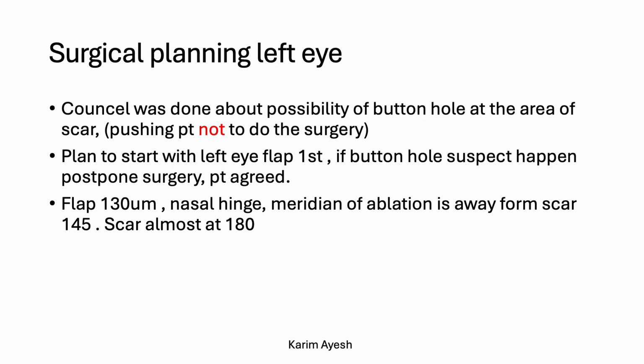So I planned to do the left eye first, or the left flap, and to watch the laser. If I suspect a buttonhole, I will postpone the surgery, and I discussed this issue with the patient. I planned to do a nasal hinge and a 130 micron flap.